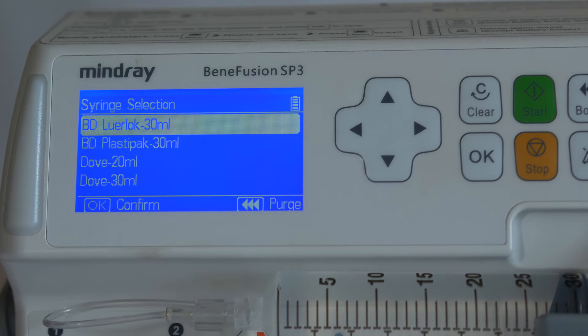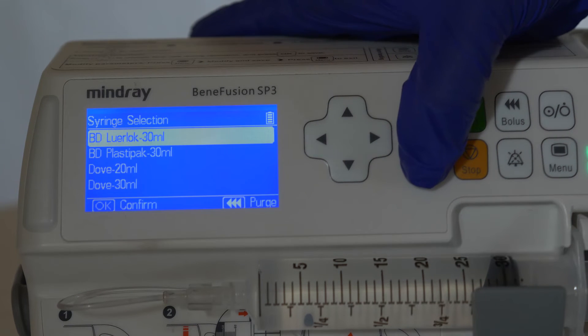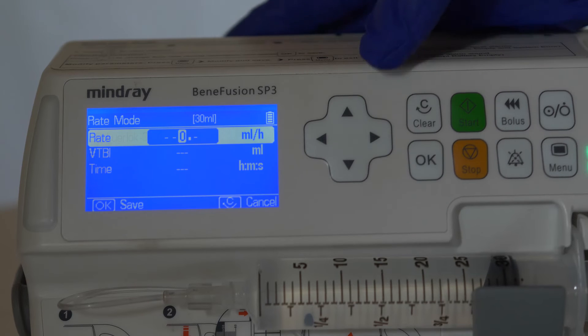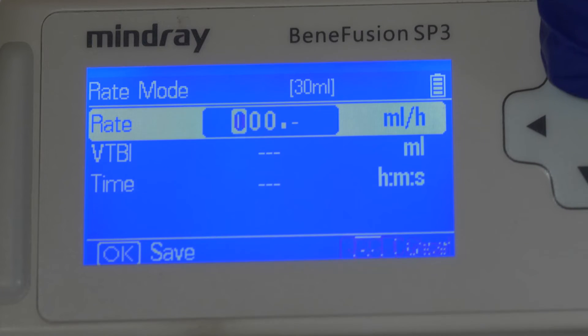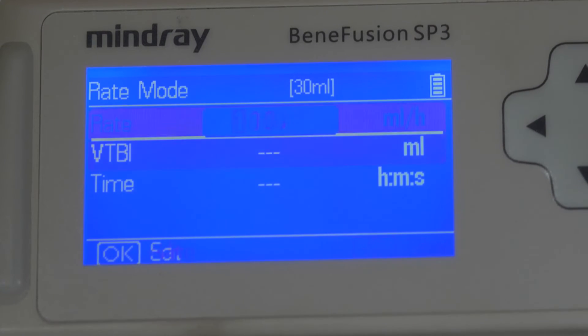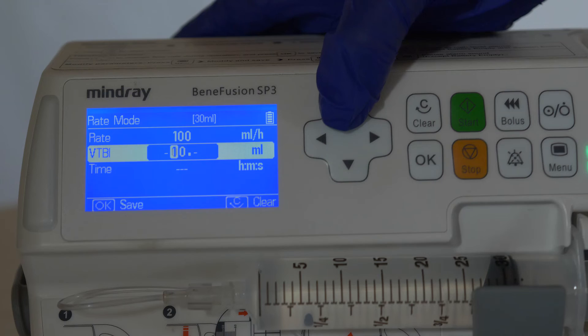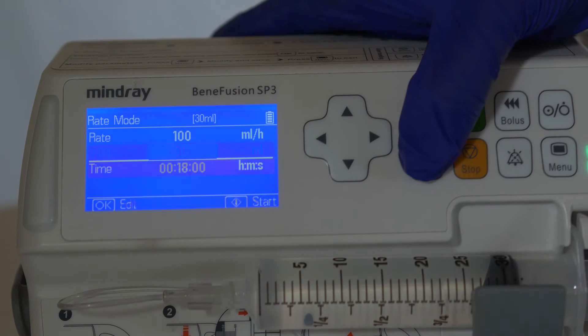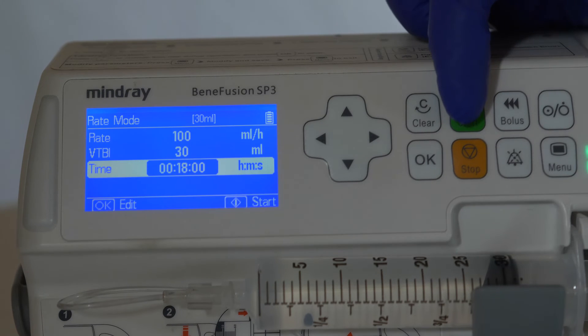The device will auto-detect the syringe size. Use the arrows to navigate to the correct syringe brand. Press start to begin the infusion.